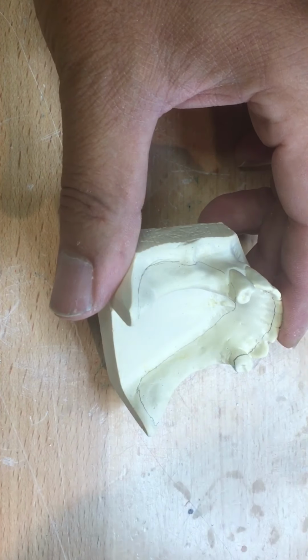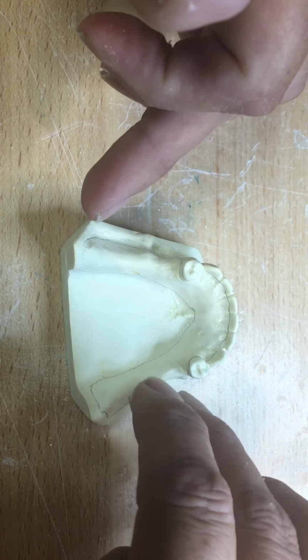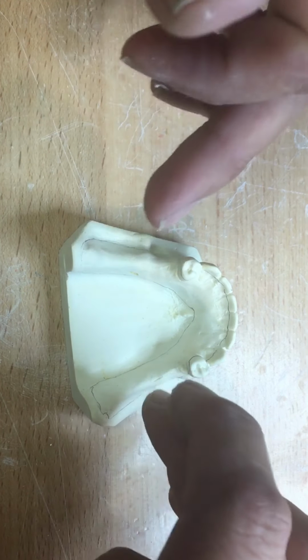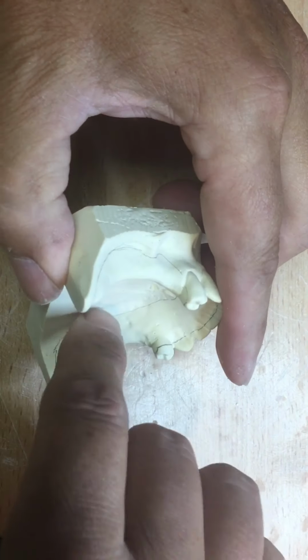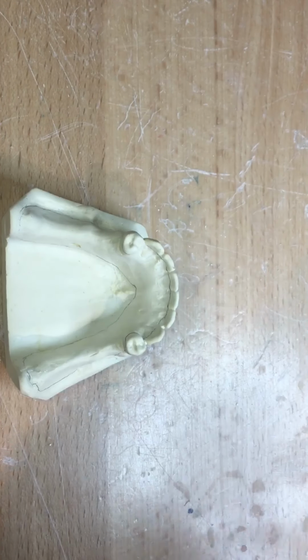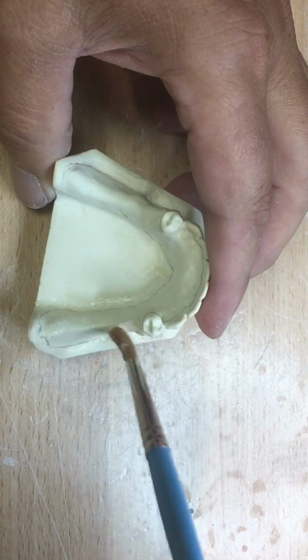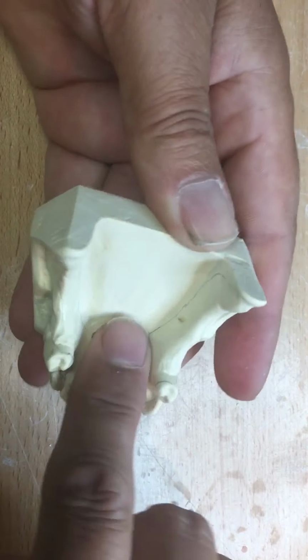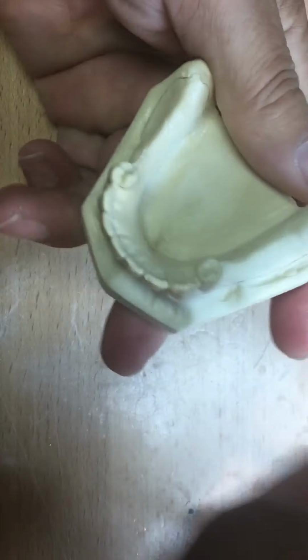So you can use a brush, you can use your finger to create a barrier of separation between the gypsum, calcium sulfate, and the light cure base plate material. I'm going to use Vaseline. I think Dent Supplies sells something that looks like Vaseline. It's called Model Release Agent, but it has the same petroleum properties. So I need to be a little liberal with my Vaseline here on the model.